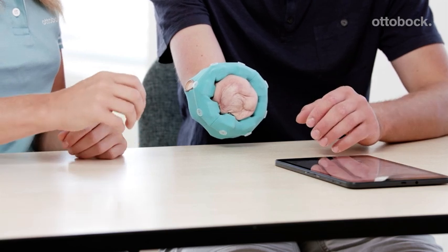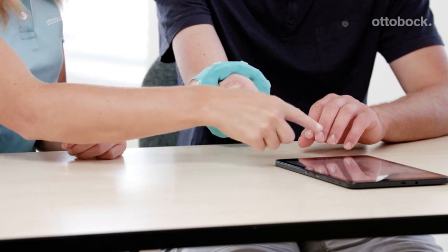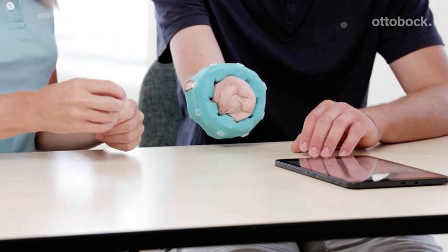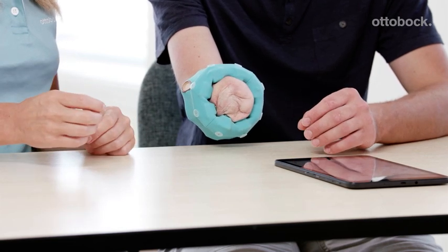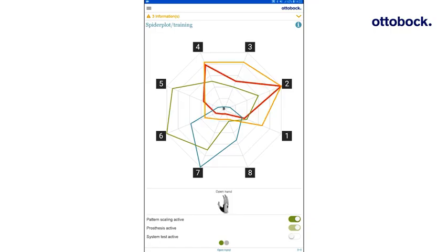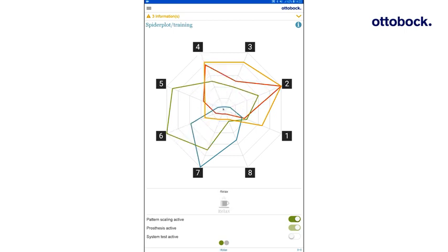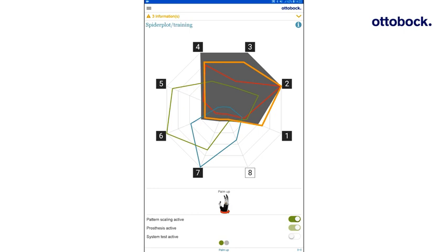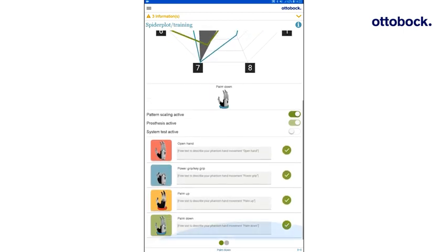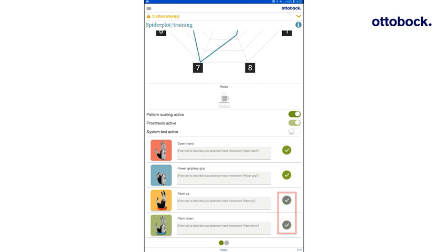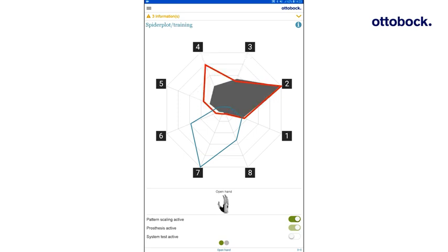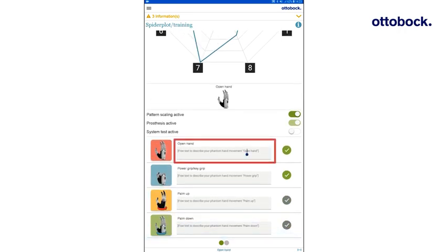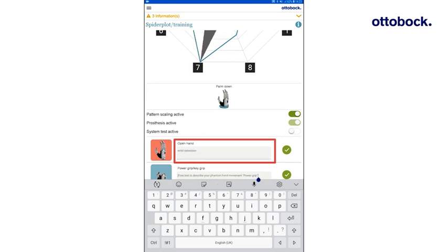Advise the user to mirror the movements with a contralateral hand. Inform the user if you notice deviations between the performed phantom movements and the movements that were recorded in the test set. Compare the current gray movement pattern to the recorded colored pattern. Pay attention to whether they look similar. When the current movement pattern is recognized as a prosthesis movement, the colored pattern is highlighted and the associated prosthesis movement is displayed below the spider plot. When training particular movement patterns, it can be helpful to deselect other patterns. Then only the selected patterns are displayed. In case the user forgets the performed phantom movement, it can be described in a free text form. This help text is displayed in different areas in the app.